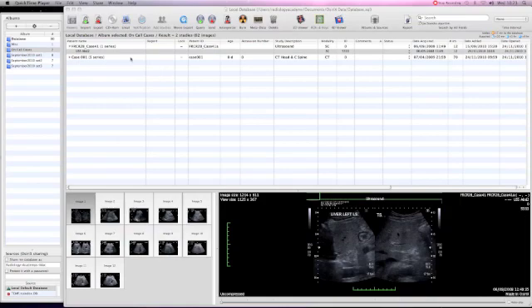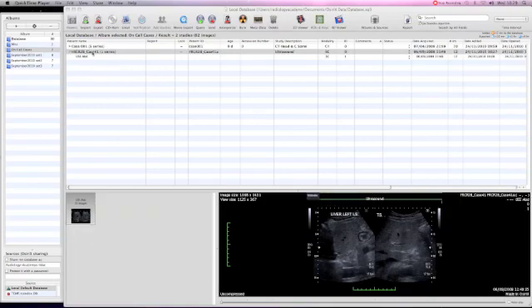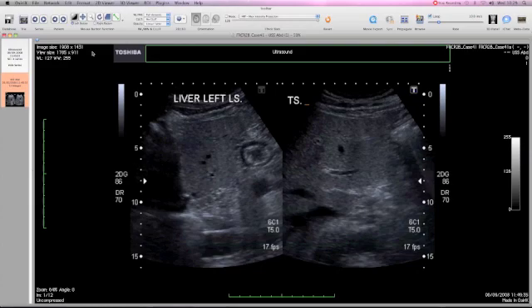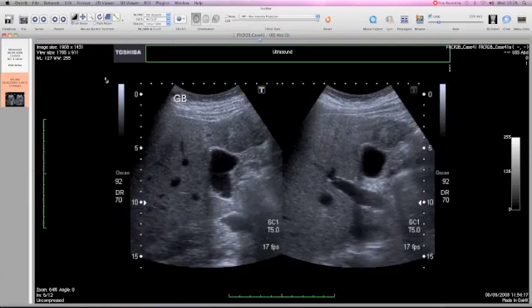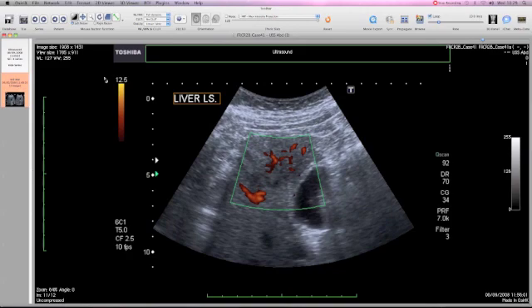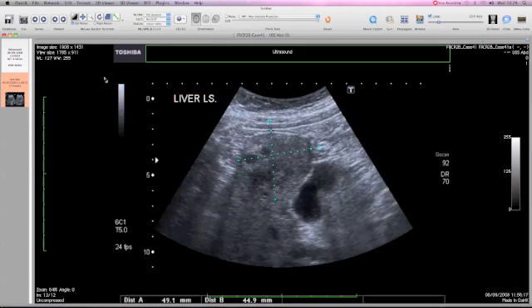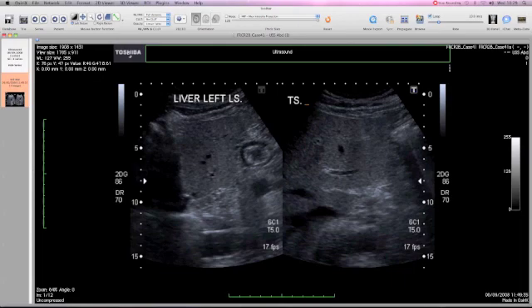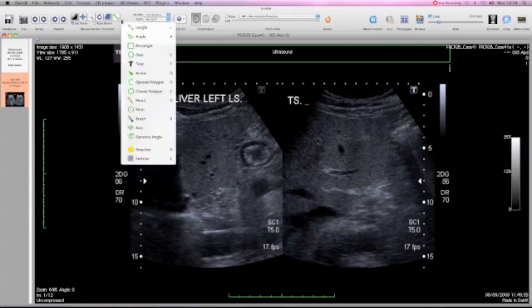Another very useful editing function is the ability to lose patient information from ultrasound and nuclear medicine examinations, which are burned onto the film and not part of the DICOM data set. In this particular ultrasound image, we've already lost the patient data. But we're just going to show you how to lose the Toshiba logo, which is a similar process to losing the patient name.